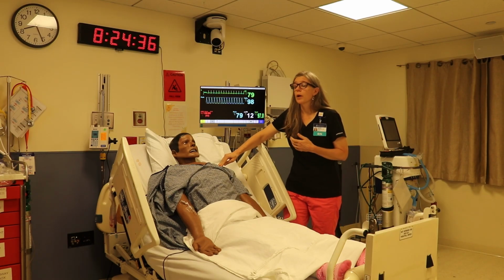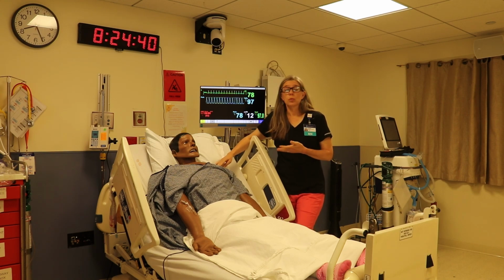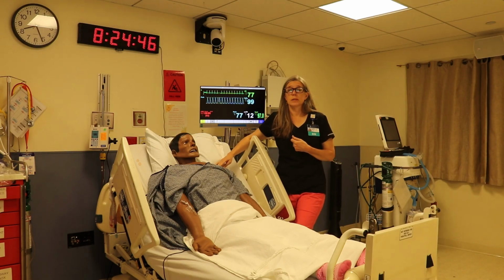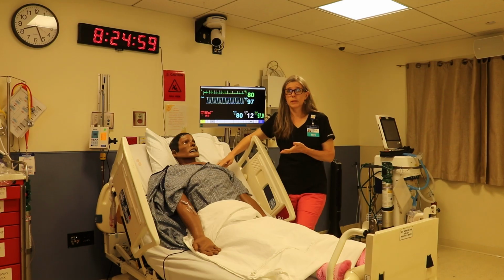In addition, the operating software can provide us with valuable information. It can tell us about the rate and depth of chest compressions when you're doing CPR, and you may be provided information about the quality of your chest compressions. It can also display tube placement if you've intubated the patient, and you will also be provided information about tube placement post-intubation. As great as he is, he does have some limitations.